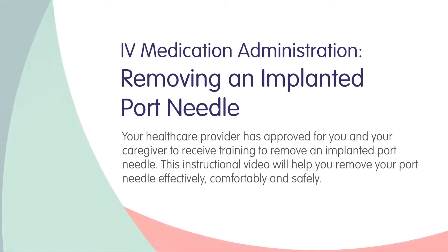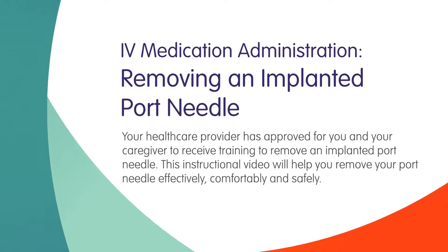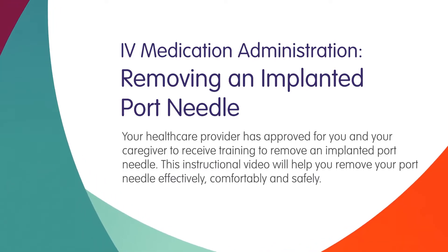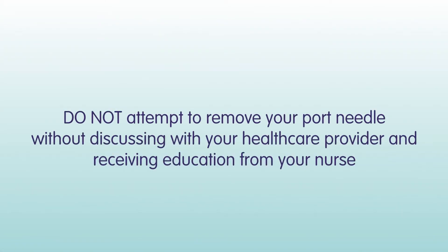Your health care provider has approved for you and your caregiver to receive training to remove an implanted port needle. This instructional video will help you remove your port needle effectively, comfortably, and safely. Do not attempt to remove your port needle without discussing with your health care provider and receiving education from your nurse.